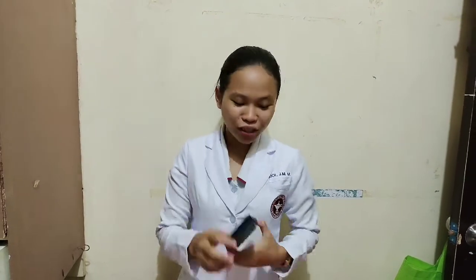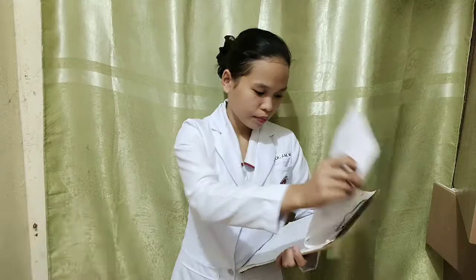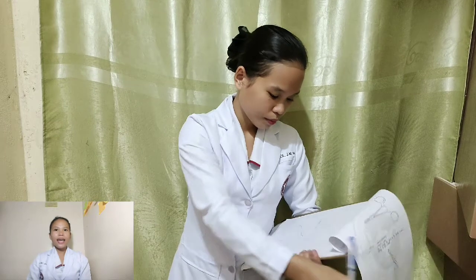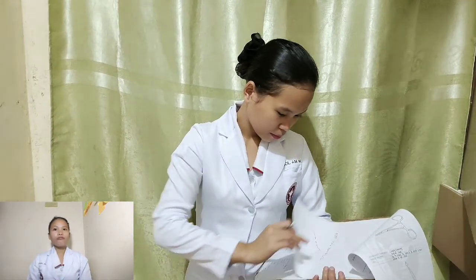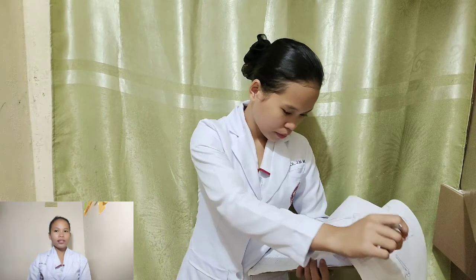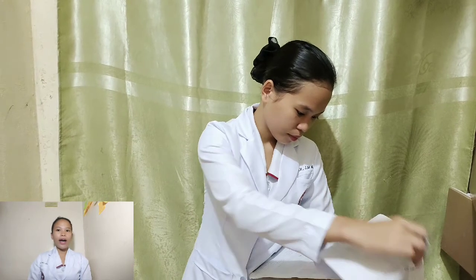These are the materials needed for regulating the IV flow rate. First is a watch with a second hand, calculator, pencil, surgical tape, fluid label, and paper. First, review the accuracy and completeness of the physician's order in the client's medical record for the client's name and correct solution type, volume, additive, rate, and duration of IV therapy.